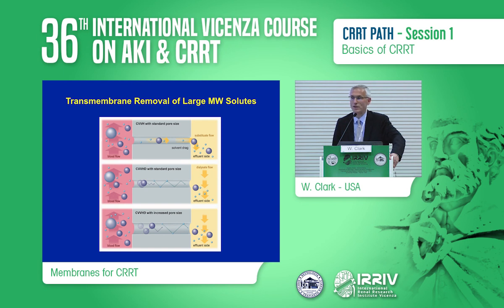Another approach is to use CVVHD with a standard pore size, since generally speaking, larger molecules tend not to be removed very well by diffusion with these standard pore size filters. There then becomes a rationale for combining a diffusion-based therapy like CVVHD and also increasing the pore size. And that combination may enhance the removal of these larger molecular weight targets.